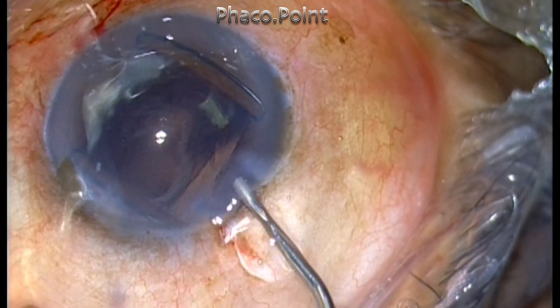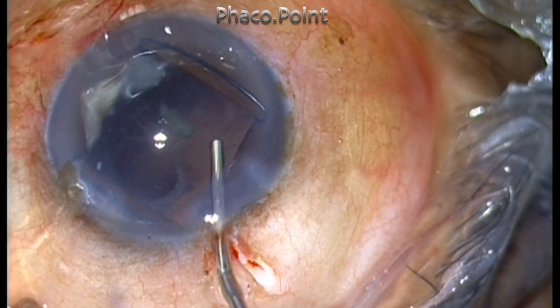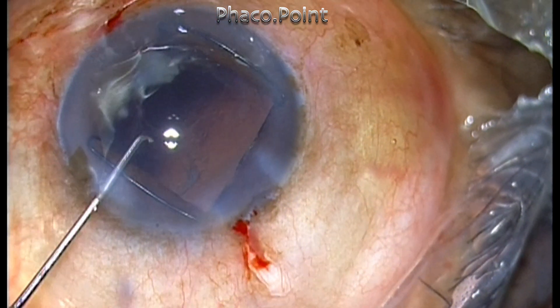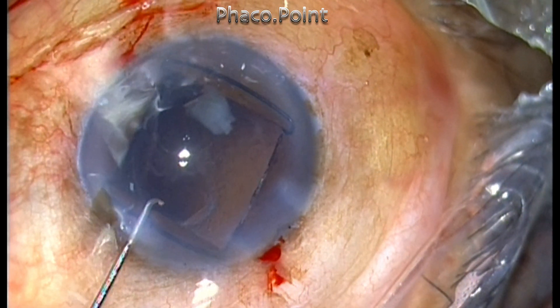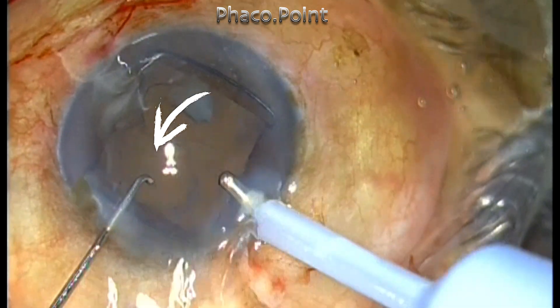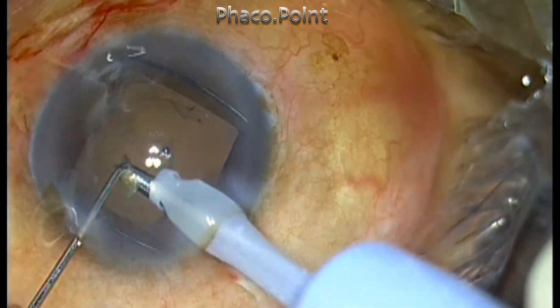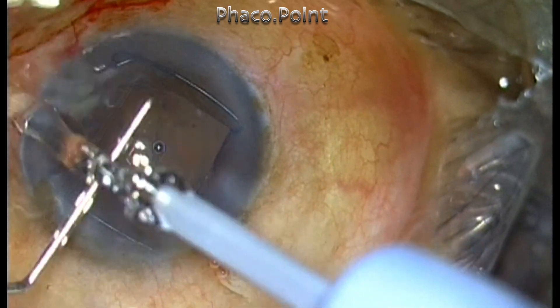After removing the last piece, I find a small nucleus fragment in the anterior chamber. I try to float it out using viscoelastic but accidentally send it underneath the iris. I then decide to remove it using the coaxial I/A itself. The posterior capsule is extremely thin and there is an area that looks suspiciously like a PC rent — but it is nothing but cortex. I retrieve the piece; with high vacuum you simply pull it out of the incision, provided the piece is small enough.